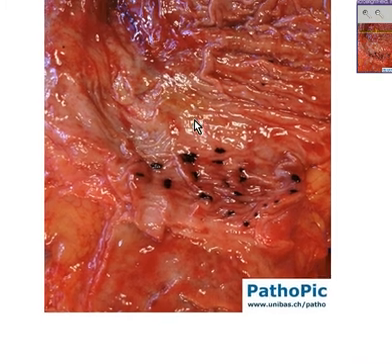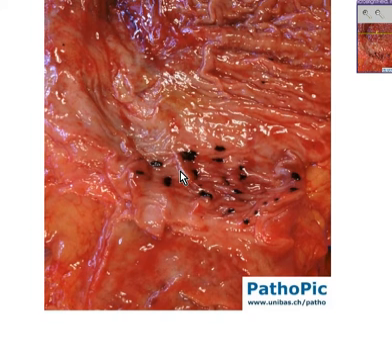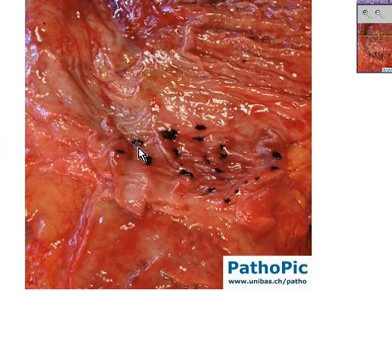In addition, along the stomach mucosa, you see 1, 2, 3, 4, 5, 6, 7, 8, 9, 12, 13, 14, 15, about 20 little areas in which the mucosa is covered with small ulcerations, or for all practical purposes, the same as the term erosion. Let's take a nice little section through here, through the full thickness of the stomach, and look at that just a little bit better.